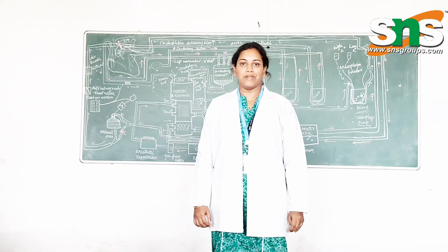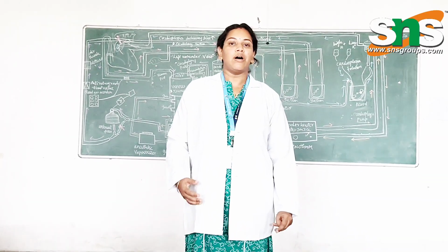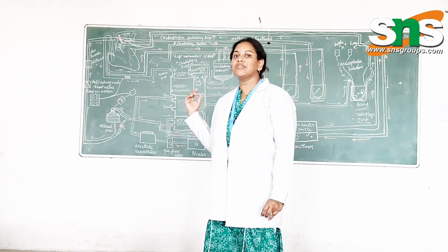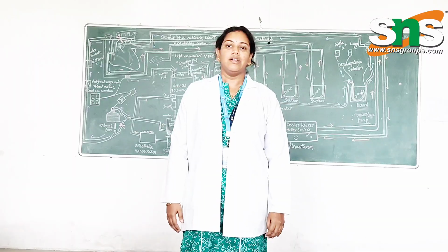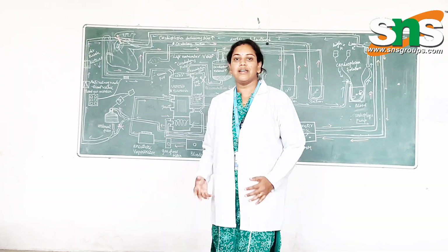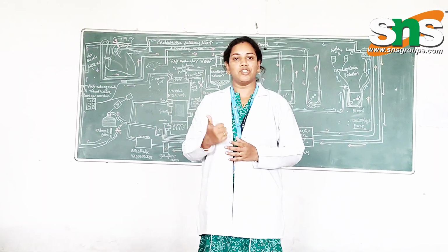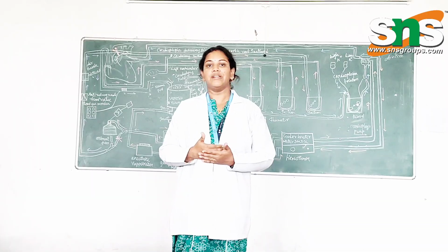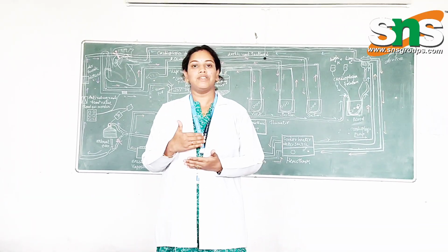The heart-lung machine is a very complex circuit. But the perfusionists take over all these functions, with almost 13 monitors they are monitoring. The circuit looks complex, but understanding the circuit will save the patient's life. The patient will be kept as dead on the table. Why? Because their heart and lungs will not be functioning. Here, this machine will take over the function of the heart and lungs. So it is important in every part of a surgery. Where it is an open heart surgery, it is impossible to do it without a perfusionist.